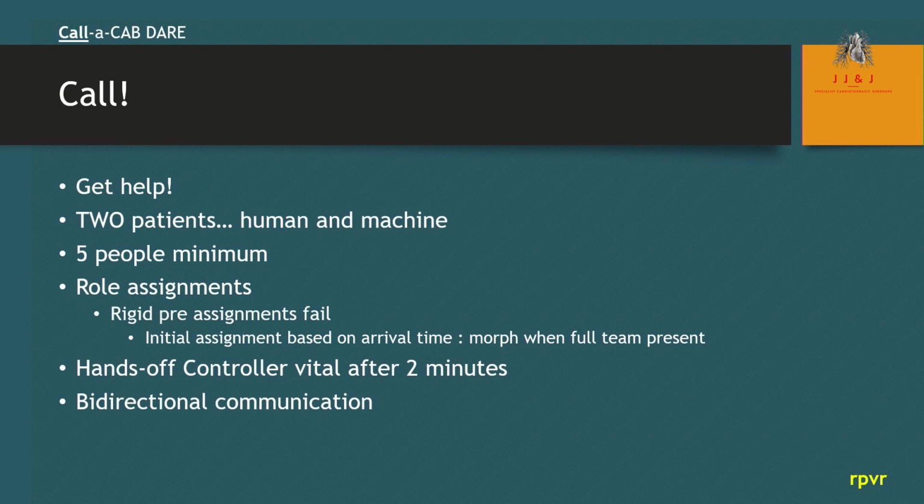When the patient has a cardiac arrest, in fact, any ECMO emergency, guaranteed you cannot manage this completely on your own. When you've got a patient on ECMO, you've actually got two patients. There's the real patient, and then there's the mechanical patient that might be the cause of the problem or might be suffering because of the cardiac arrest. And you need to have attention to both.